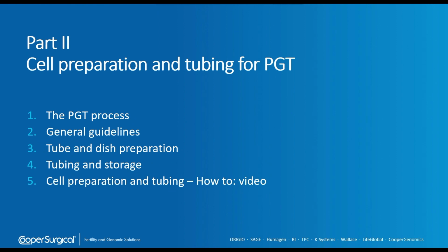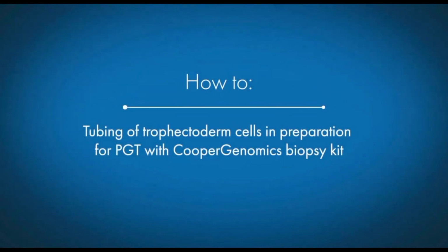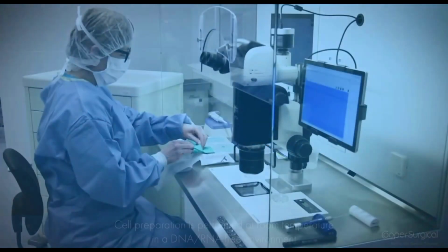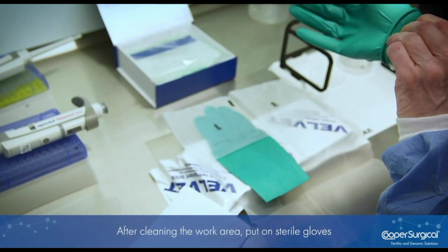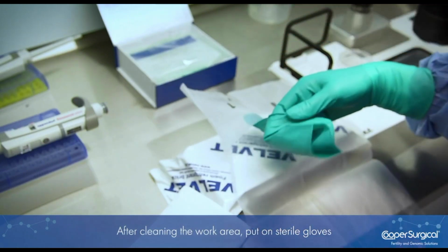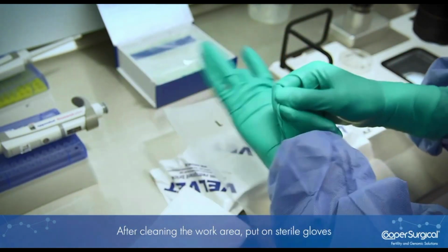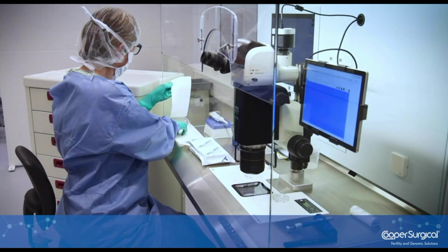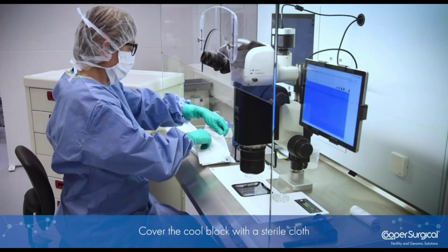Okay, let's now look at how this will work in practice, and I will guide you through the steps while watching a recorded video. Before you start, you have to make sure, as I said, that the area is cleaned, and that all the equipment you use in there is cleaned, DNA, RNA free, and only dedicated to tubing. We will also have to wear protective personal equipment: surgical gown, a mask, non-powdered sterile gloves, and we have to cover all our skin because the skin could contaminate the tube cells.